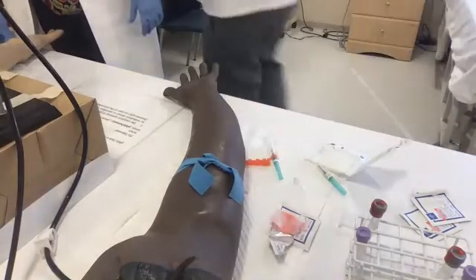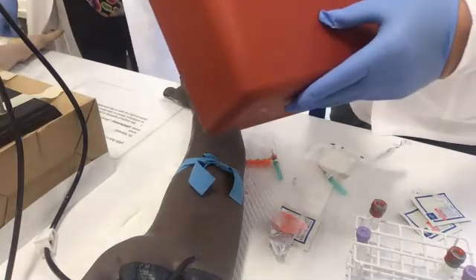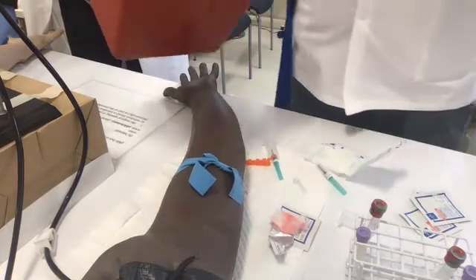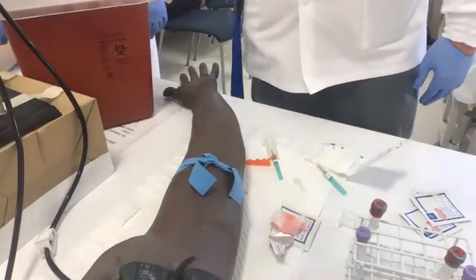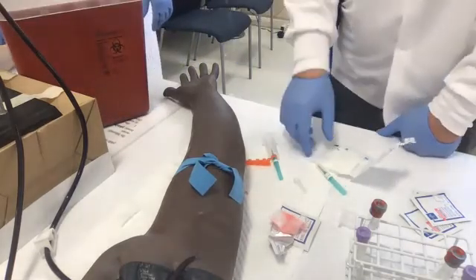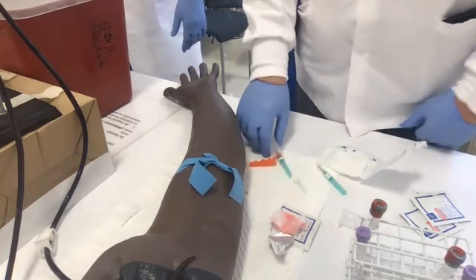Oh, another thing I always forget: the sharps container. And how do you know it's sharps? It has the biohazard symbol, and it'll say the word Sharps, and it also only fills to this level. You never fill up one. If I could show you, you only put sharps in here. There's a whole bunch of wrappers in here, gauze. Hey, wasn't my class. Something to talk to somebody else about, but it was not us. So if I have something blood soaked, it's going to go in the biohazard, but not the sharps. What only goes in the sharps? Sharp things. So let's start.